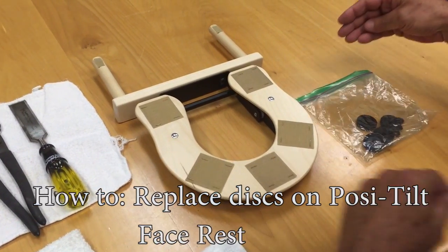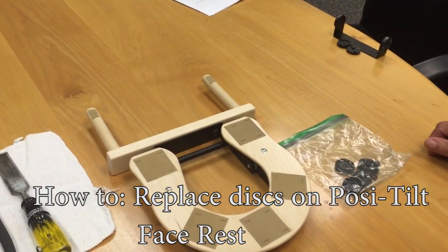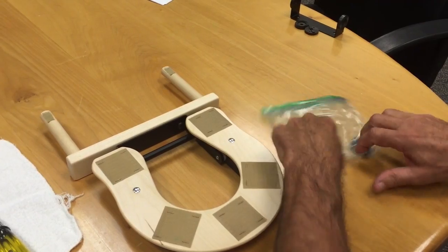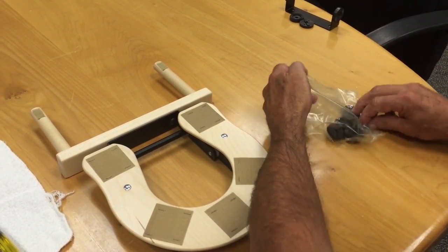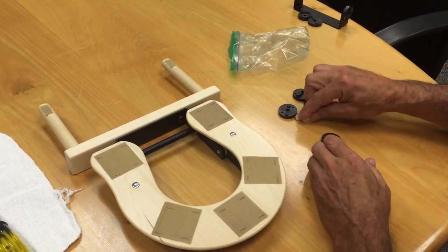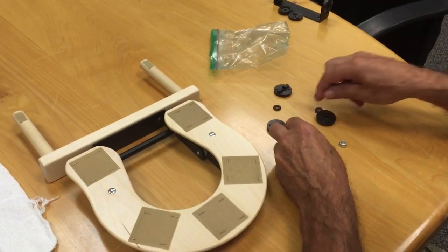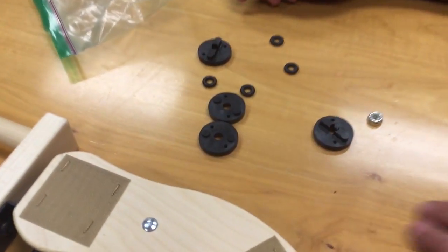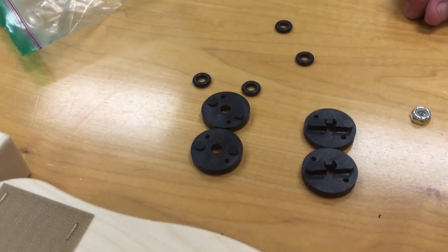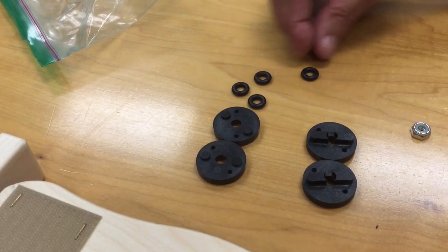Okay, so we're going to replace the discs on our Posi-Tilt FaceRest from Custom Craftworks. When you're sent the repair kit, this is what you'll receive. There should be one nylock nut, 2 discs with short posts, and 2 discs with long bars, as well as 4 O-rings.